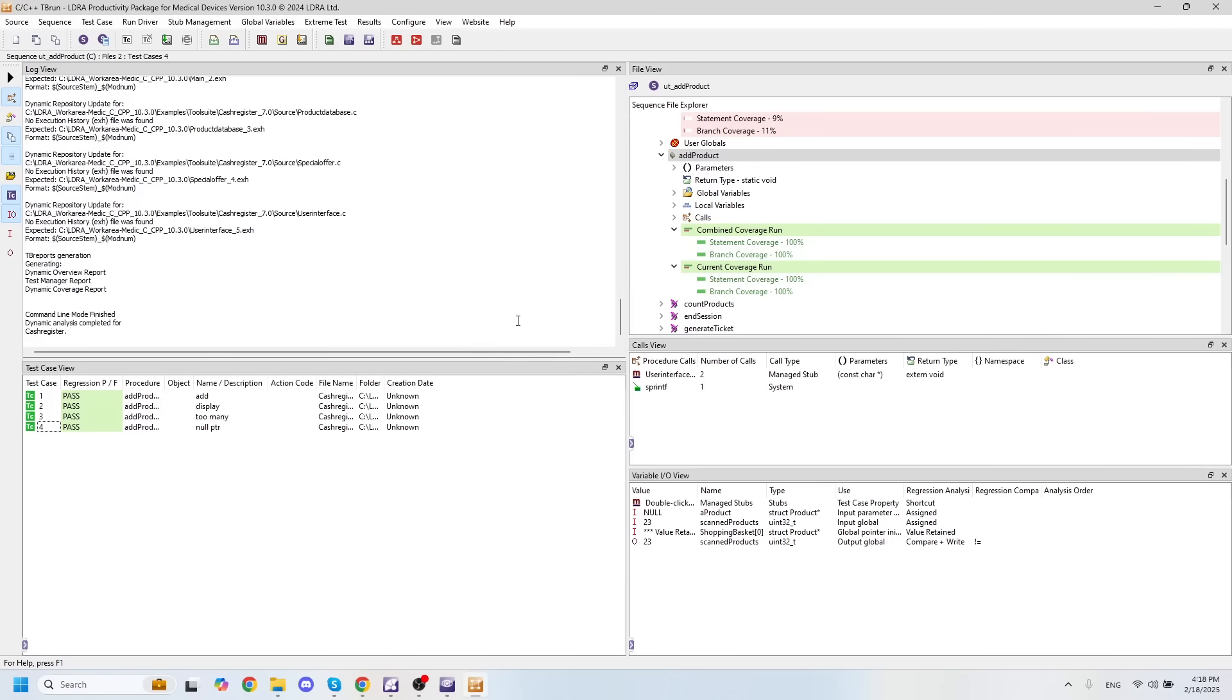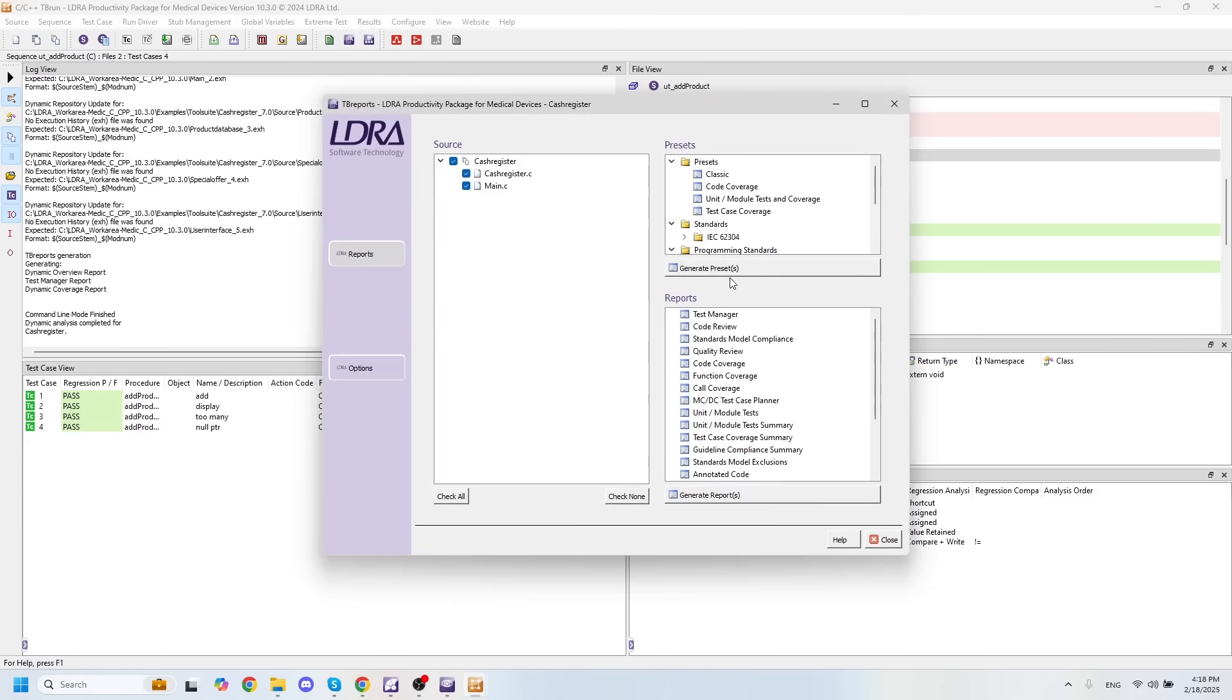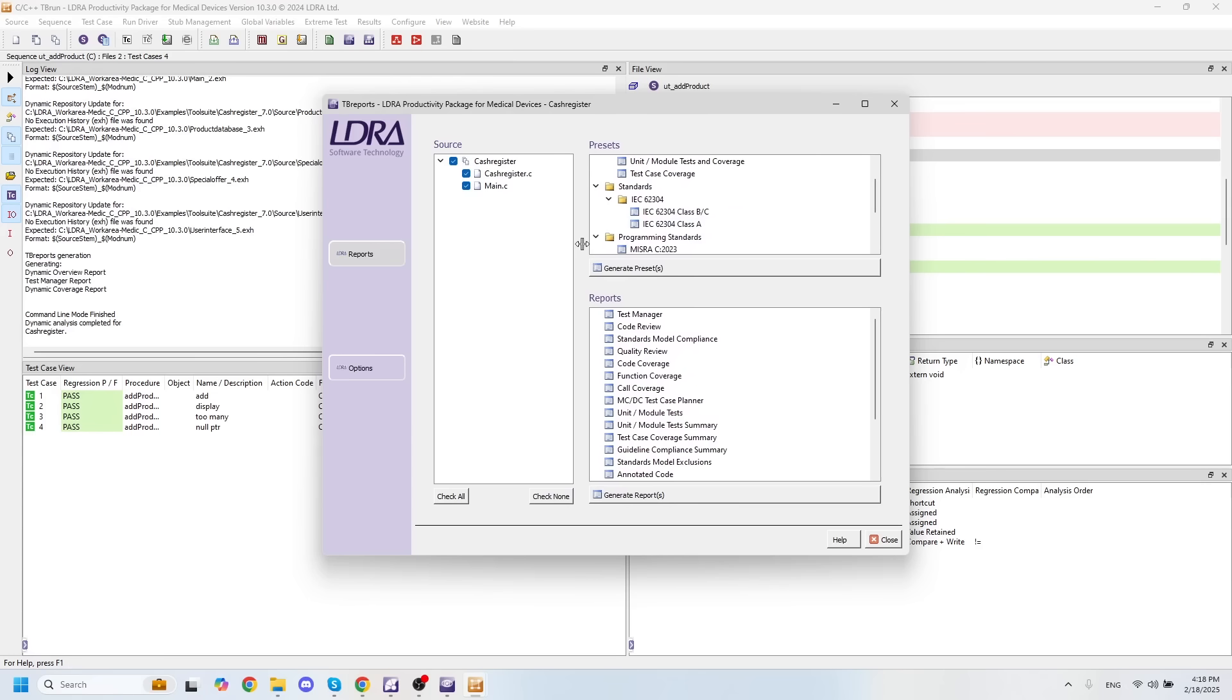The final thing that we'll want to take a look at in the LDRA productivity package for medical devices is going to be all of the reports that we've generated along the way. And more specifically, reports specific to IEC 62304 and the different class levels.